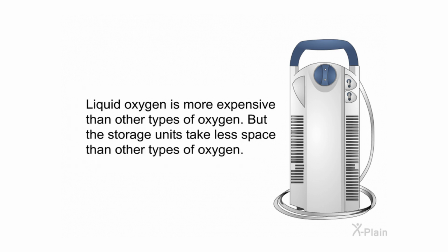Liquid oxygen is more expensive than other types of oxygen, but the storage units take less space than other types of oxygen.